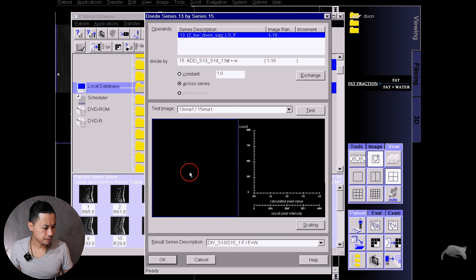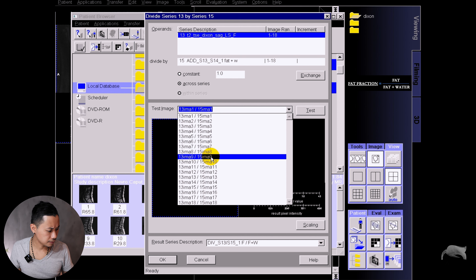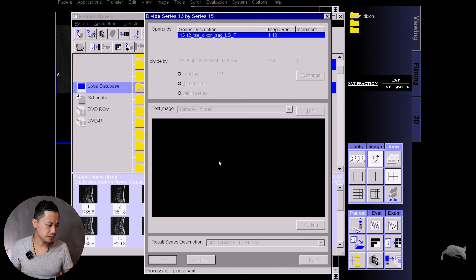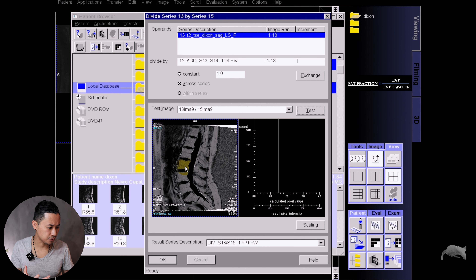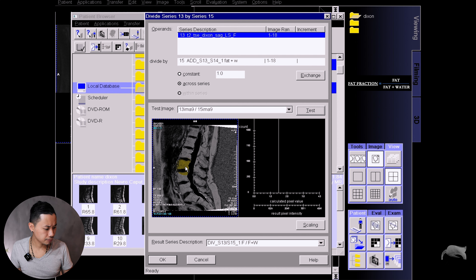An easy step — hit Exchange. Now it's fat divided by fat plus water, just like the equation I showed you. I'm going to rename it: 'fat divided by fat plus water.' There's one more step — you need to go to Scaling and put a factor of 1000, because it will be easier whenever you do a region of interest and read the information.